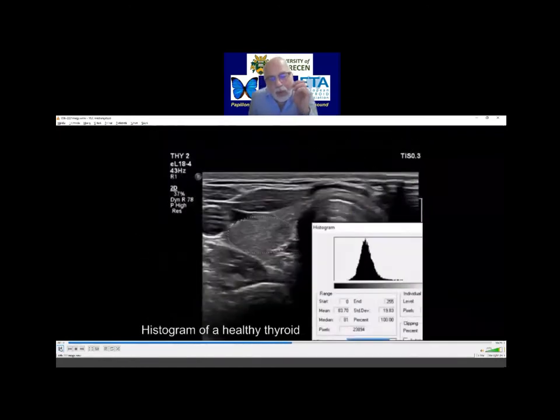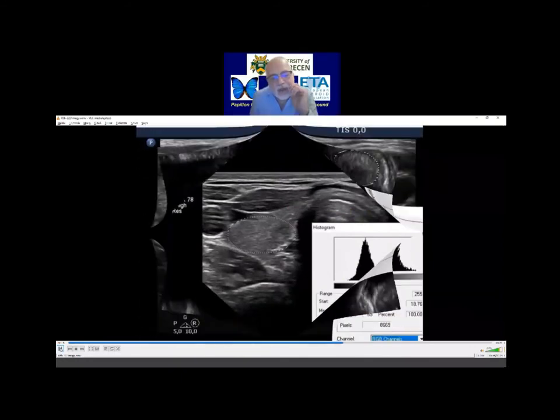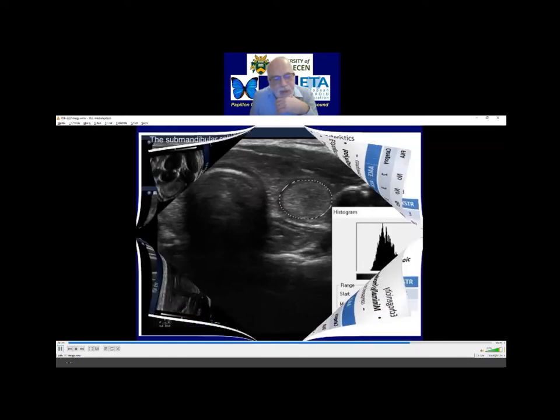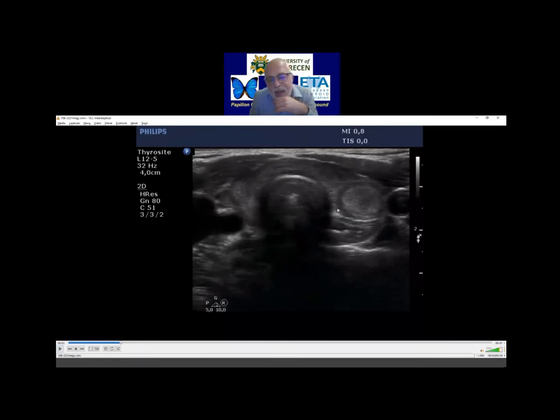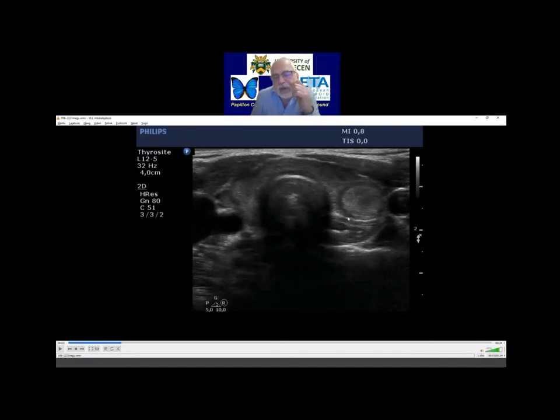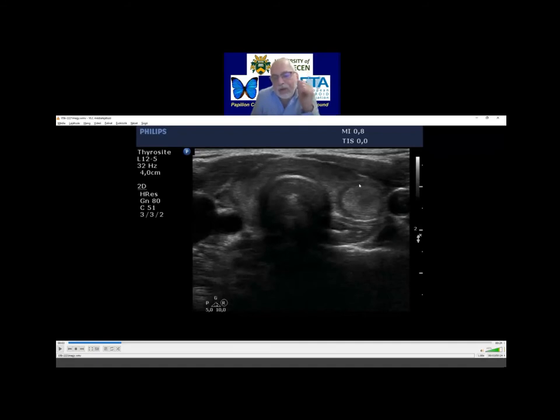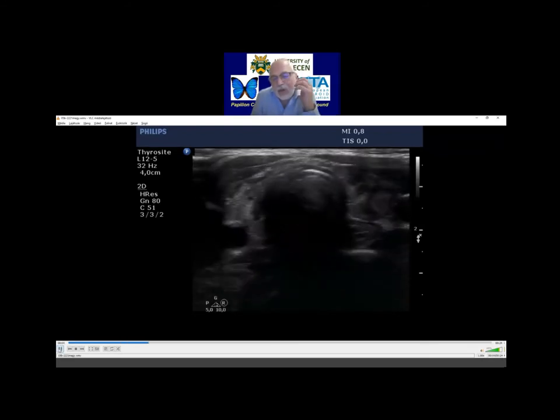I don't think that each and every isoechoic nodule should be sampled. But a nodule which has a halo sign — we know that halo is generally a benign sign — however, the halo is one of the ultrasound signs of a follicular tumor, including follicular cancer. By definition, a follicular cancer should be surrounded by a capsule. If the pathologist does not find an intact capsule, then the lesion could not be a follicular tumor. The more important sign of the capsule is the halo. So the halo is a controversial sign.